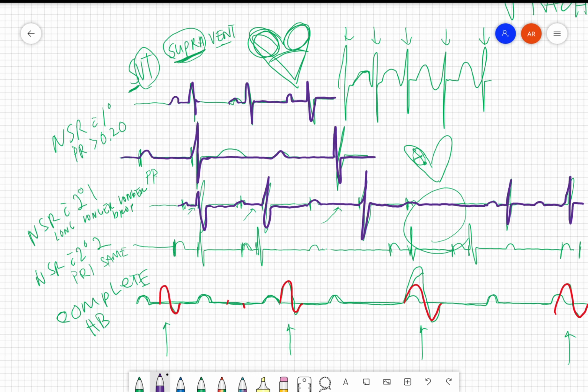Second degree type 2. It's either he's going to take it out or he's not going to take it out. There's no quarreling between, no fighting in between each time. She'll ask and he'll take it out. She'll ask, he'll take it out, and then he's just not going to do it. And then the next time she asks, he does it. He does it. He doesn't do it. It's pretty rhythmic still. It's either he's going to do it or he's not going to do it.